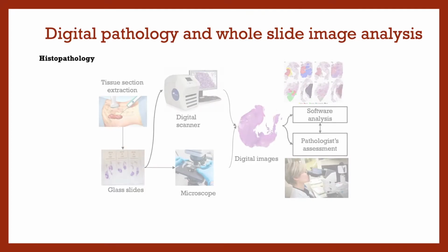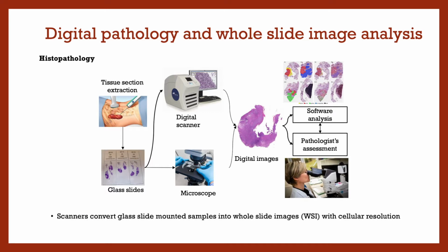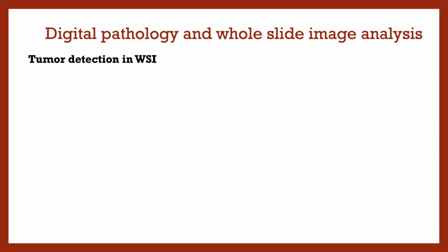Histopathology is the process of extracting and visualizing human tissue sections for disease diagnosis. Modern slide scanners are now capable of converting glass slide-mounted samples into high-resolution whole slide images at multiple magnifications for examination and analysis. Tumor detection is one of the major topics in digital histopathology.